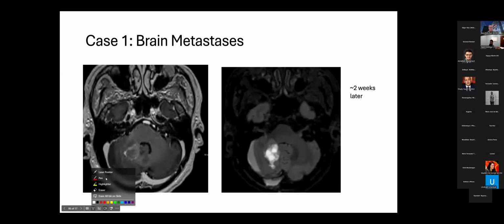Now, what I will also try to do, and I think brain cavity radiosurgery is probably the trickiest common radiosurgery case in the brain. Many trials have shown increased risk of local failure after brain cavity radiosurgery. And there are a couple of reasons why when we come to planning and contouring.